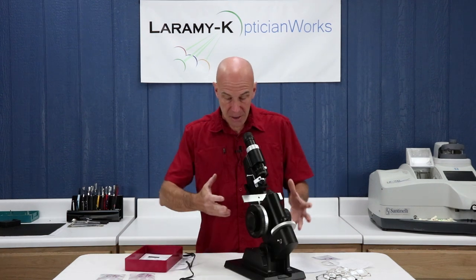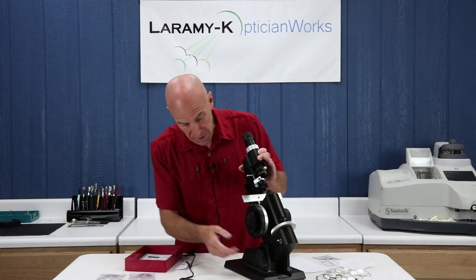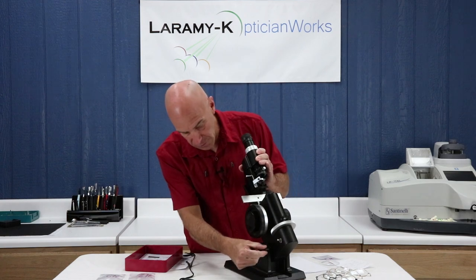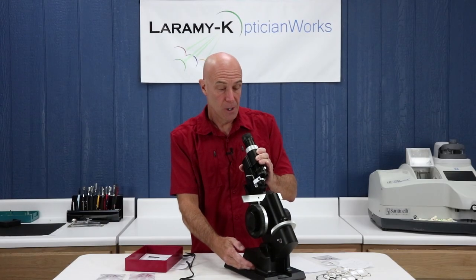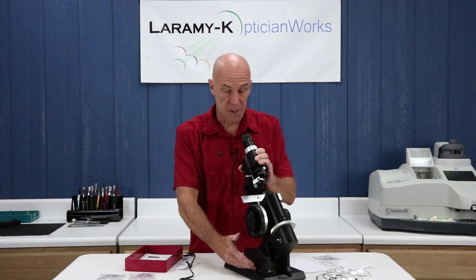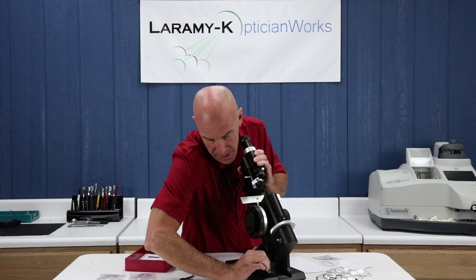The next step is setting the lens meter up for your own personal use. The first step is using the position locking lever, which does just that — it allows you to adjust the angle so that it's comfortable for you to use. You might be tall, you might be short, you might be sitting or standing. Find a spot that's right for you and then lock it down.